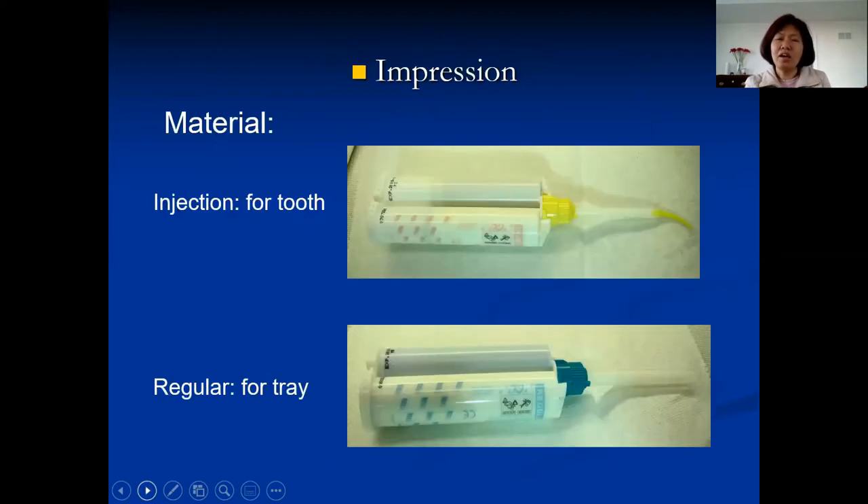For impression material, there are two types shown here. The light body goes in the gun and is injected around the teeth — it's very runny and picks up more detail. The regular body is used to load the tray. Heavy body material is also available — it's thicker, with no big difference from regular body in results. I personally prefer regular body because it's easier to squeeze the gun. However, for a patient who is a gagger, I use heavy body because it doesn't run as much.